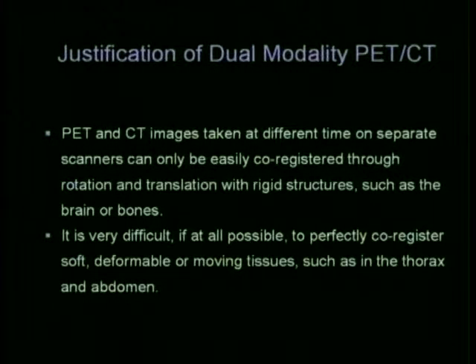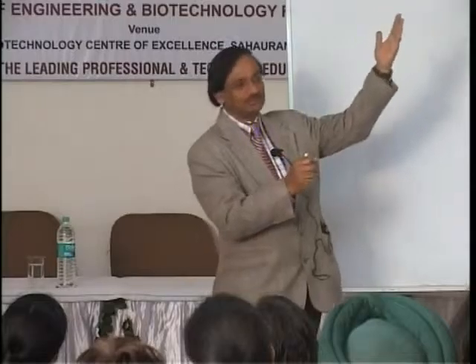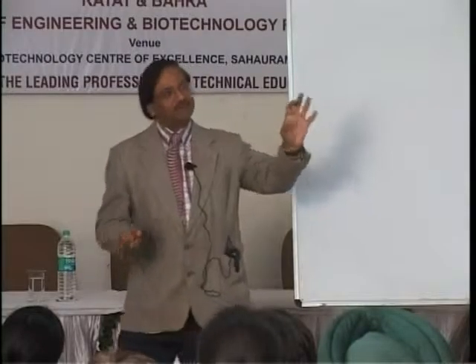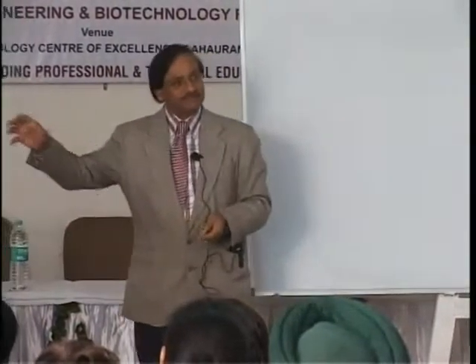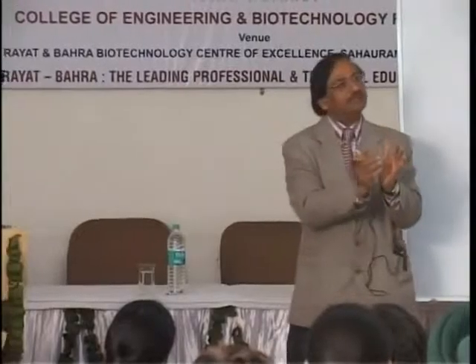PET and CT is a dual modality. We are talking about multi-modality. That means you can couple many more data sets. You need this because sometimes you do a PET study in a single scanner and you need a CT in a different scanner, maybe in two different institutions. You can couple these and have the information.